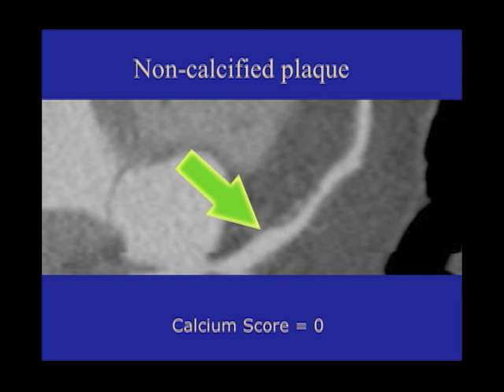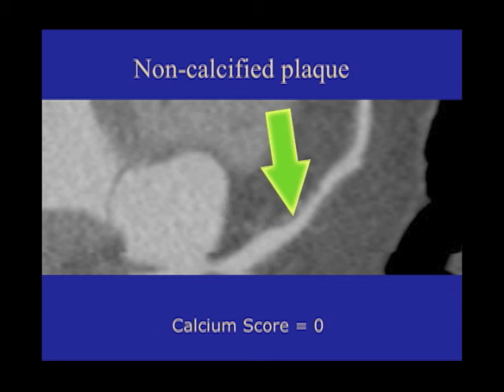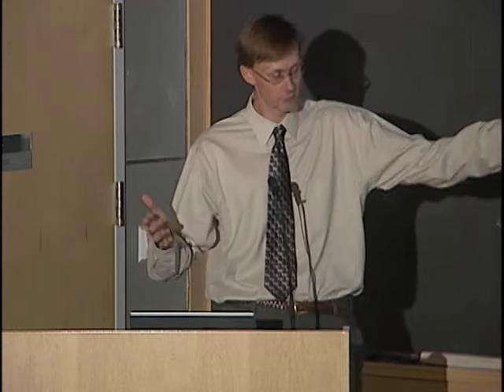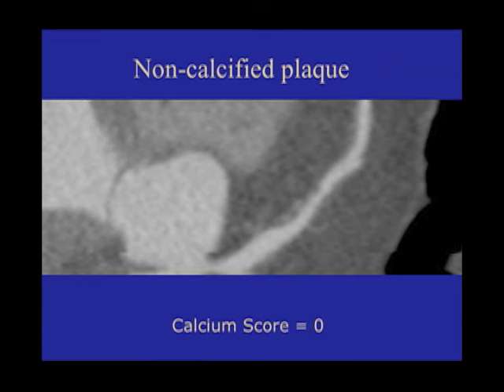There's a rapid tapering from here to here. On a coronary calcium screening CT, you won't see this at all. There are certainly patients who have significant findings that we won't see on a coronary calcium CT. But that's not the goal of the calcium CT — it's not designed to look for a specific area of narrowing.